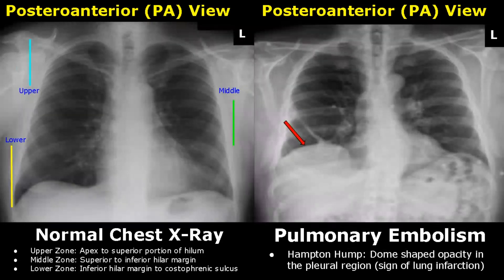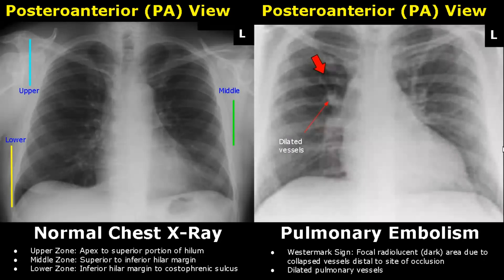Hampton Hump is the next sign — it consists of a dome-shaped opacity in the pleural region and it indicates lung infarction. In the Westermark sign, we will see a focal radiolucent area due to collapsed vessels distal to the site of occlusion. Along with this radiolucency, we will see dilated bright pulmonary vessels as well.